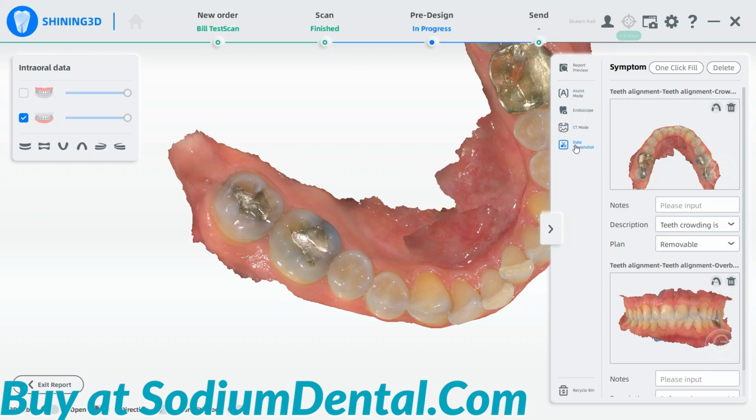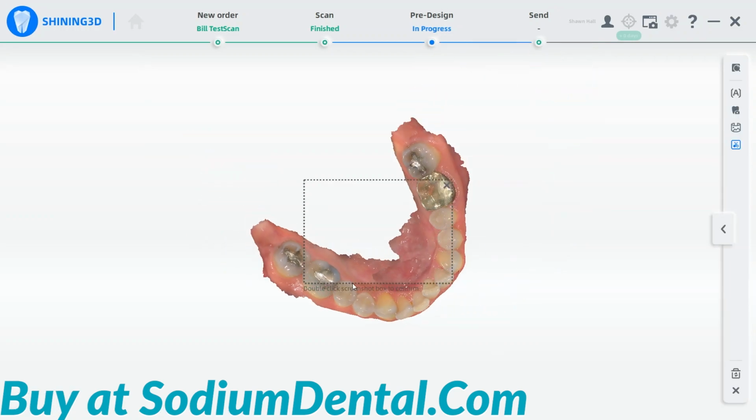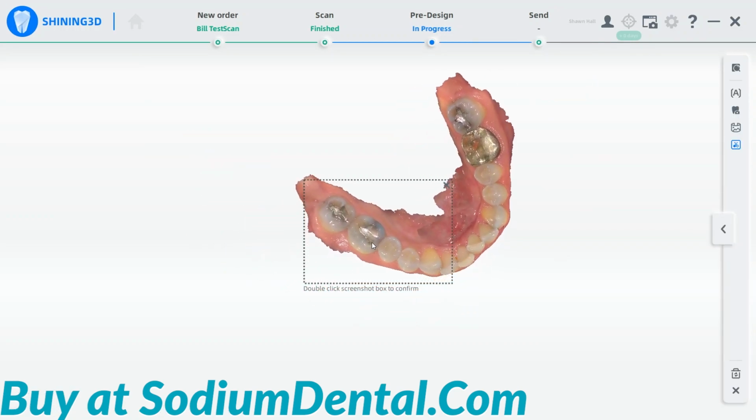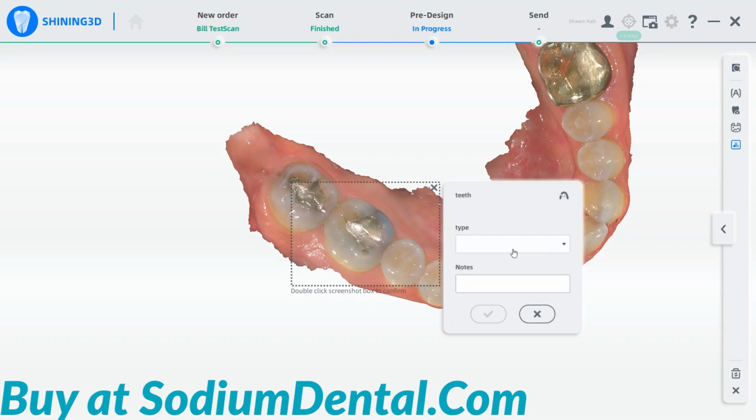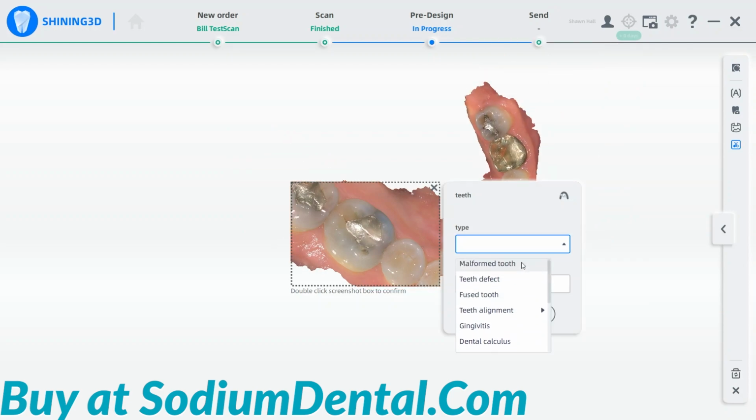Click the Data Screenshot mode. Manipulate the model into the space and then zoom in. Everything in this box will be a part of the picture on the oral health history report. I double click. I choose what I would like to assign to it. I'm going to say Other and say Potential Fracture.